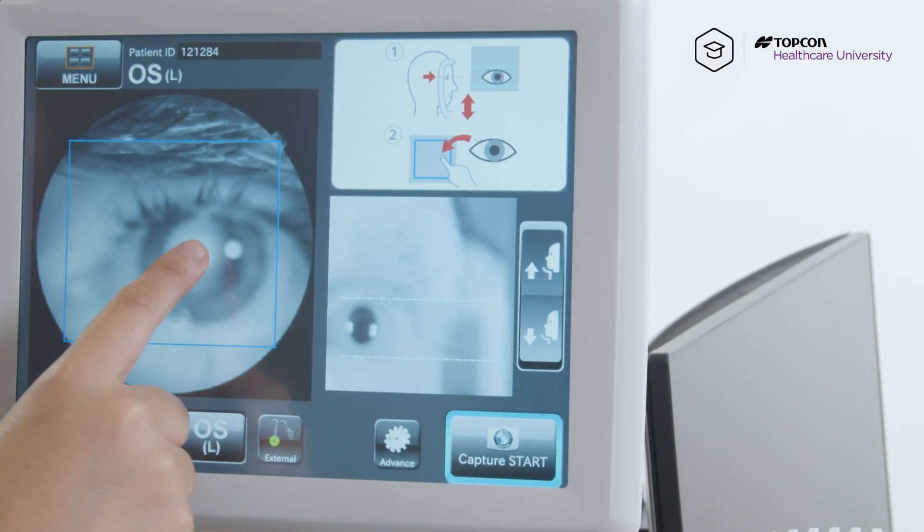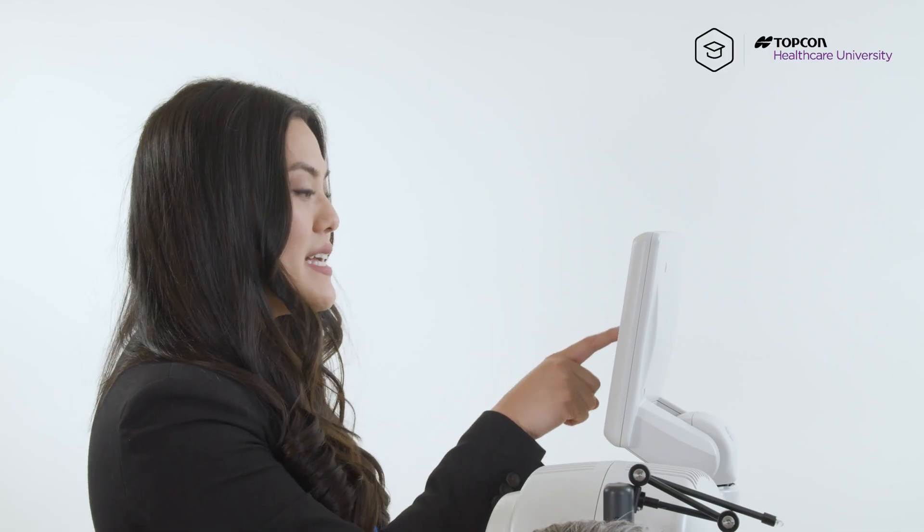So from here, we're going to center the pupil by tapping the center of the pupil. Once we have the optic disc in the red box, we're just going to hit capture start.